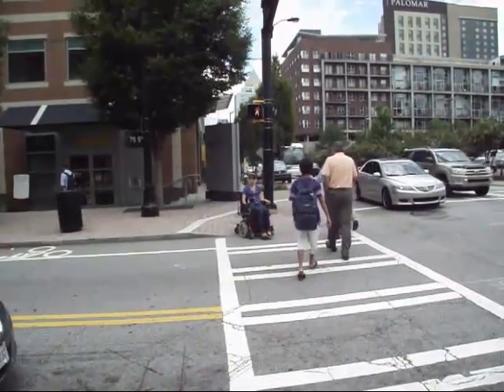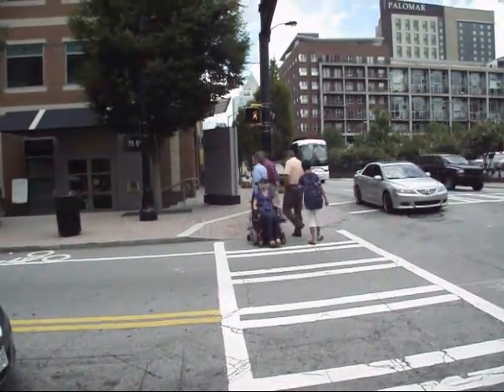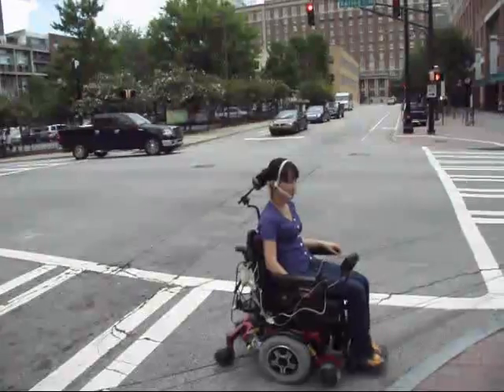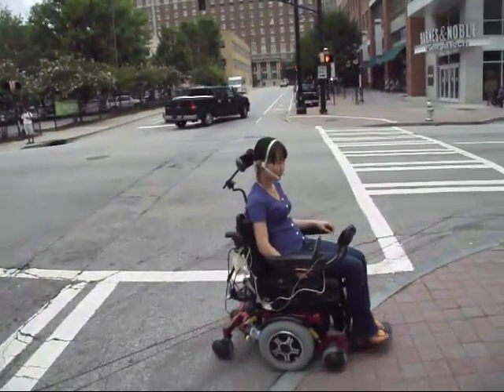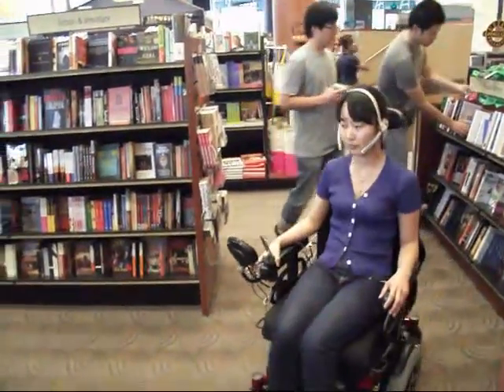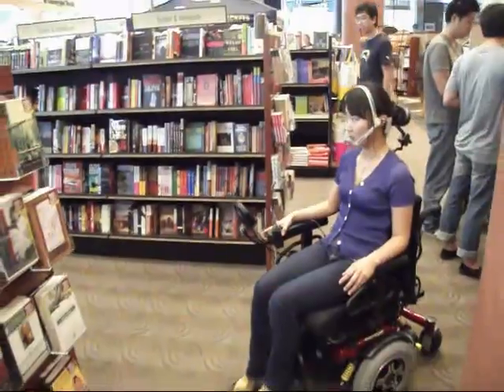The signal processing algorithm is smart enough to distinguish between tongue drive commands and regular speech-related tongue movements. With the smart and reliable wheelchair control mechanism, Zhanghi can easily drive the wheelchair using her tongue to cross the street, enter a store, and maneuver in crowded spaces to find the items she is looking for.